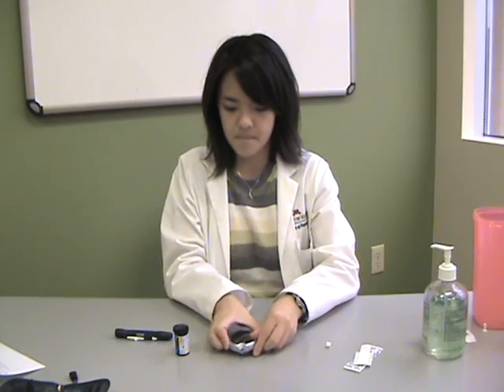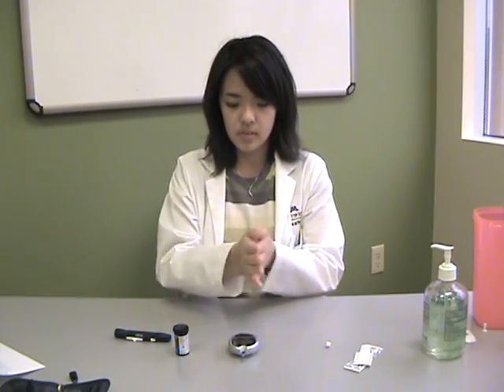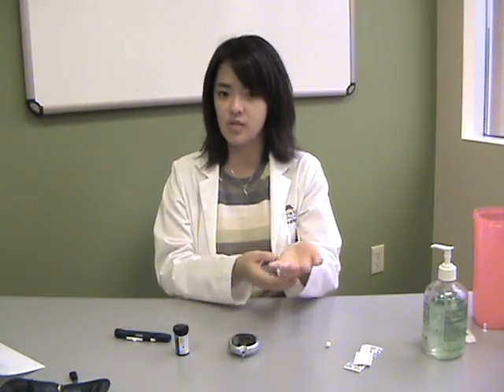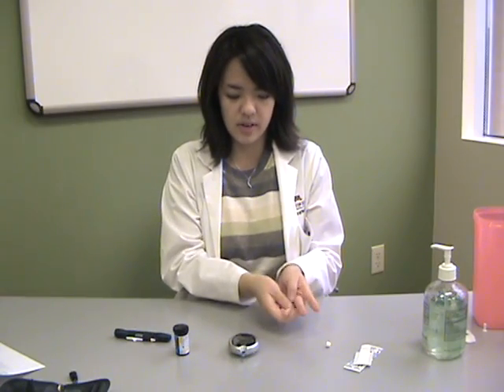If they don't match, you can adjust by using the arrow up or down. Next, you will puncture the skin to draw some blood. Start by warming up your hands. Next, you want to put your hand either on your lap or somewhere lower below your heart. Next, you want to squeeze your finger.